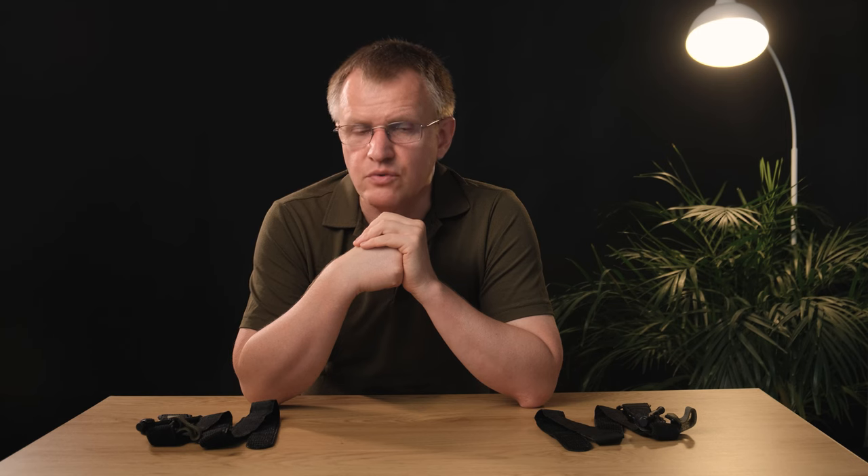It is known that in an extreme situation, a person descends from the level of their expectations to the level of their skills. Therefore, if a fellow soldier is holding a tourniquet folded in a way that is incomprehensible to him, there is no starting point he is used to from training. At best, it will take time to figure out how it is folded. At worst, the person will fall into a short-term stupor — a loss of precious time in stopping the bleeding and an increase in time spent under enemy fire.